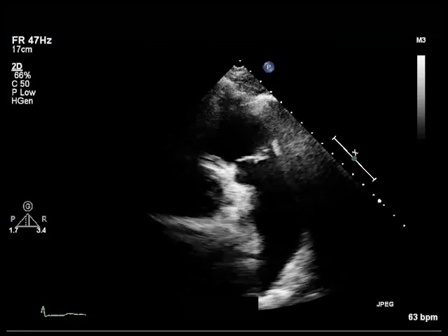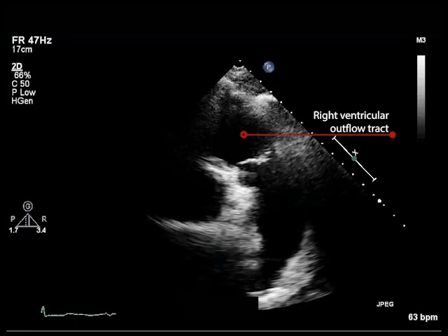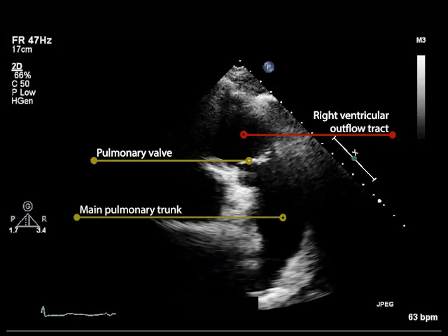From the parasternal long axis view of the right ventricular outflow tract in a healthy individual, we can see the right ventricular outflow tract, the pulmonary valve, and the main pulmonary trunk. This view can be used to measure pulmonary annular dimension and assess the pulmonary valve.